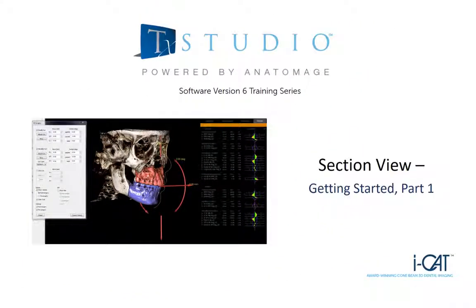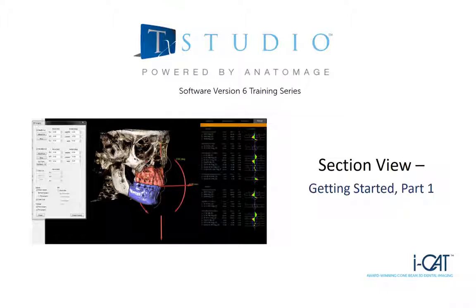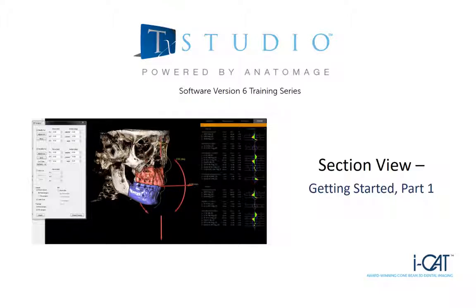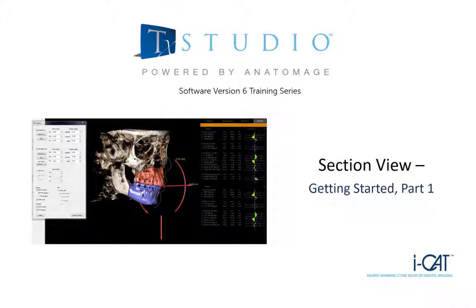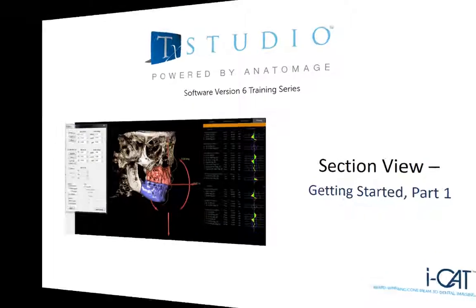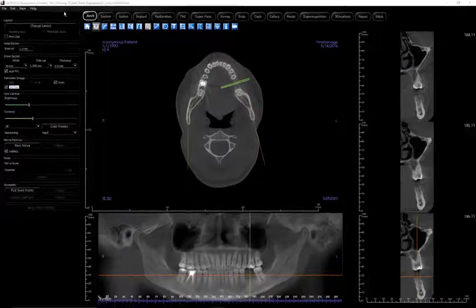Welcome to a CAVO Dental Imaging training series for TX-Studio 6, 3D rendering software. This training series will demonstrate how the software can be used to display 3D volume renderings, create cross-sections, trace nerves, place virtual implants and restore them, print images, save images, and many more functions.